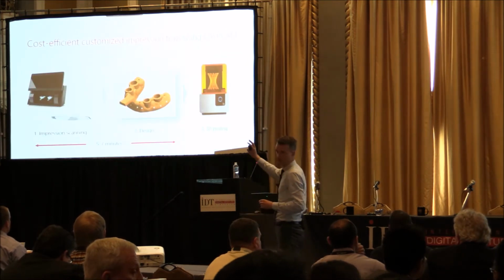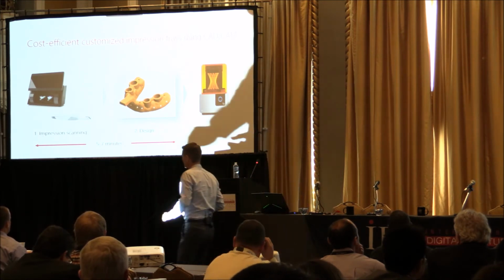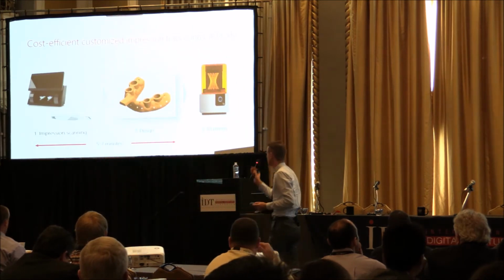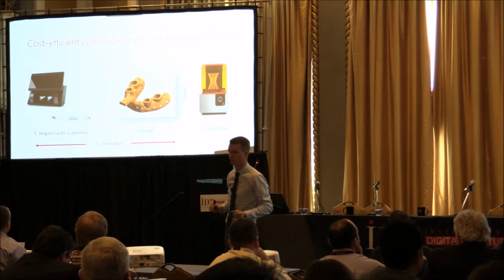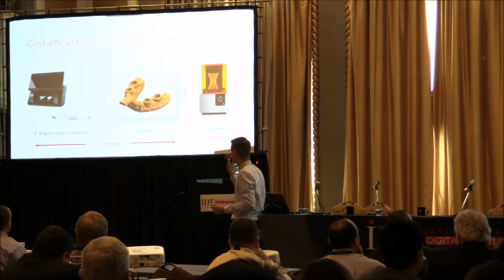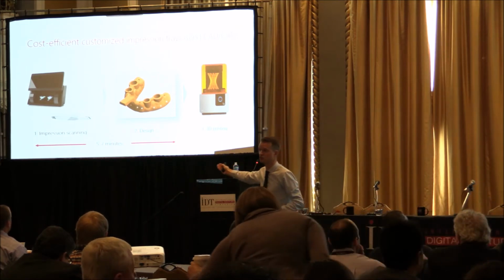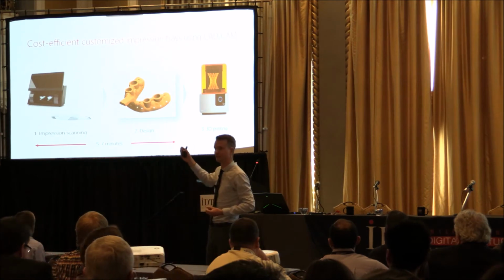All right, Justin also talked yesterday about the custom tray. I'm just going to highlight it again today, that you can do custom trays. Very efficient, 5 to 7 minutes to scan an impression. No model here. We go model free because we don't have time to make a model. So we scan the impression, or we take an intraoral scan, and you can scan impressions great today. And especially for these things here, they're so easy to scan, there's no teeth, right?